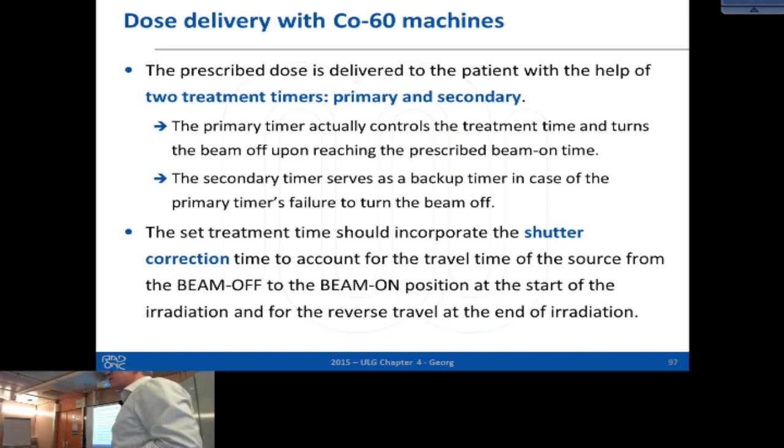The nice thing with radioactive sources is you can really calculate the treatment time in terms of seconds, yeah? Because there is this decay law, and you can use that to relate treatment time and dose, and this decay is very, very stable, yeah? And here you really press in, I don't know, 36.5 seconds treatment time or something like that, but still you have a secondary timer, so you have some security mechanisms if this primary timer doesn't switch off the beam, in a similar way like the primary dose monitor chamber in an accelerator.